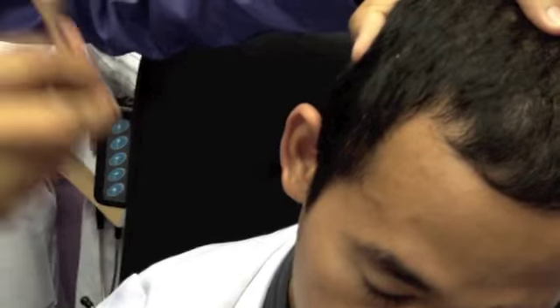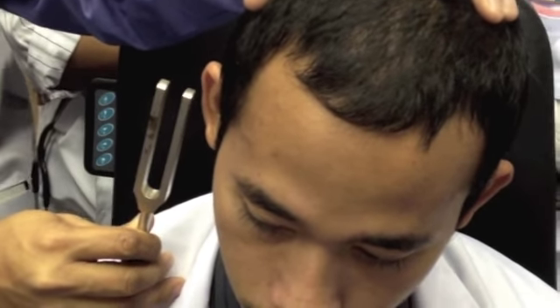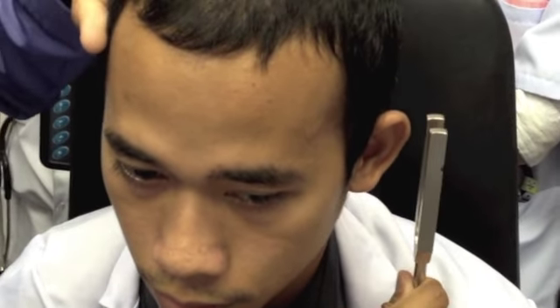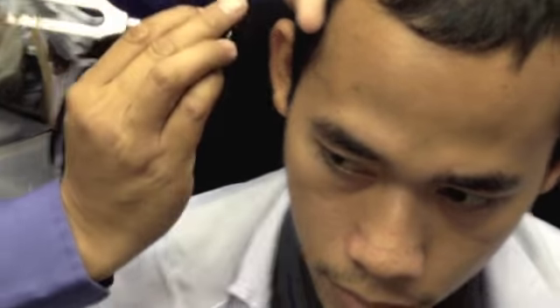Then when you put at the air conduction part, you put like this. Okay? You put like this. Like this. Not like this. Not like this. Vibration. Huh? Not like this, of course. Not like this. Not like Harry Potter.